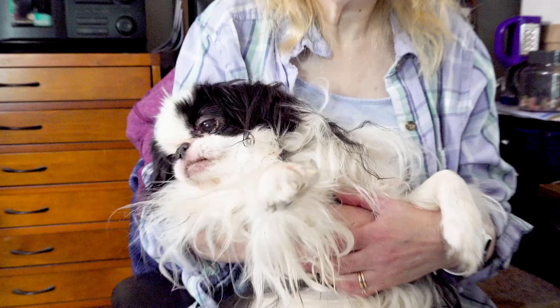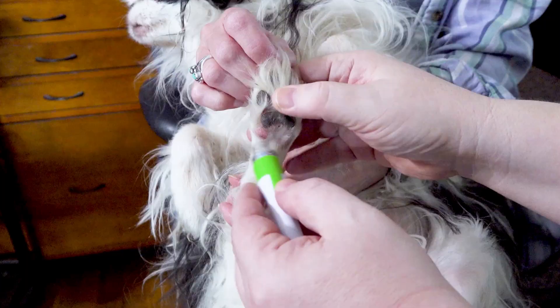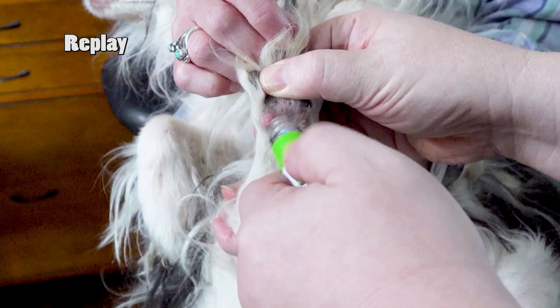I'm going to get ready to poke him. Look how chill he is. Get ready — look, he didn't even flinch. Get a little drop of blood there.